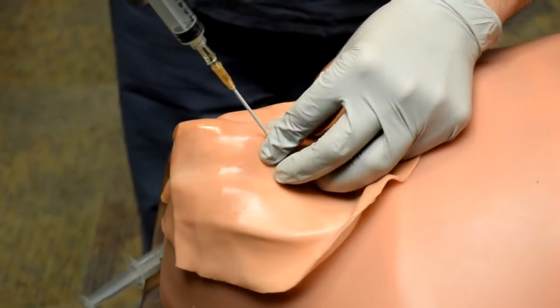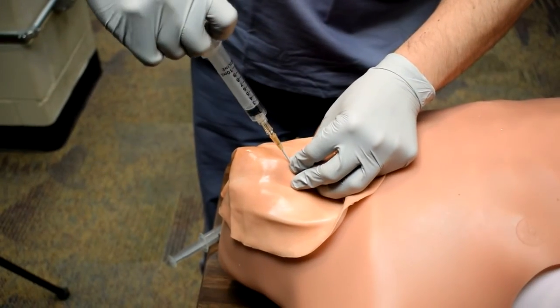I use my right hand and insert the needle at a 45-degree angle and insert it until I get air back.